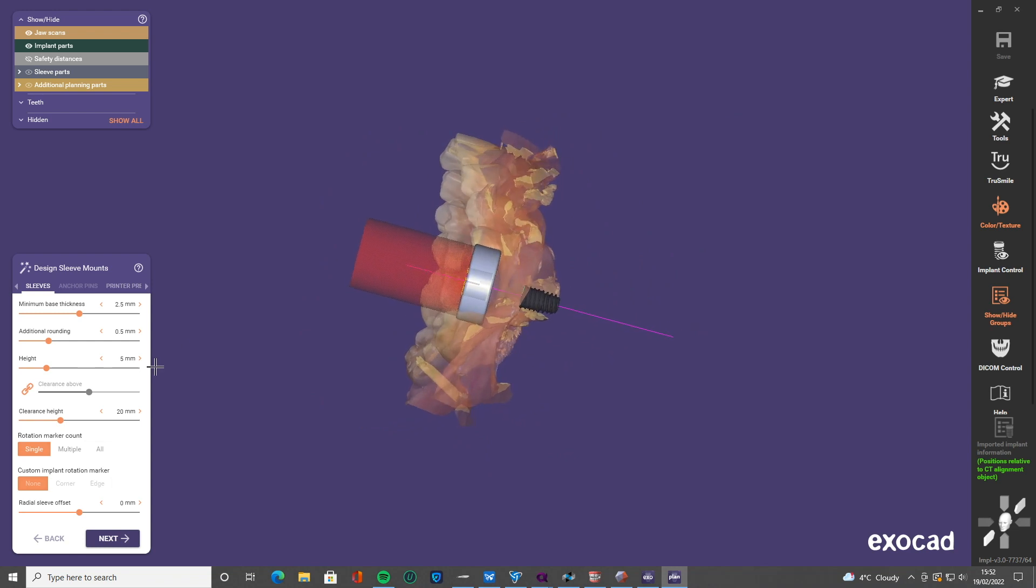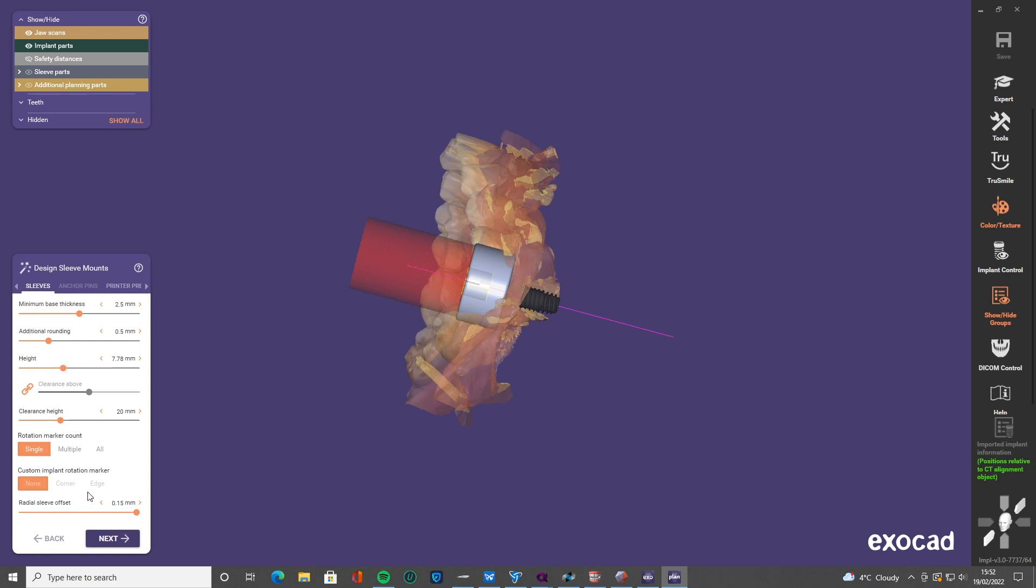I always like that sleeve mount to connect to the bottom of the guide, and I also like to have it offset just slightly so that all my tools fit through really nice and easy. And my height, I'm going to increase so that it sits right down to the base of the guide there as well.